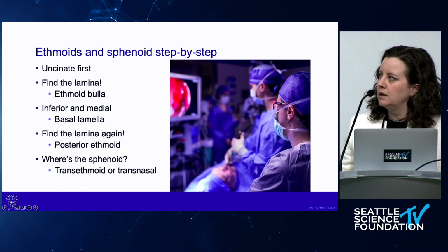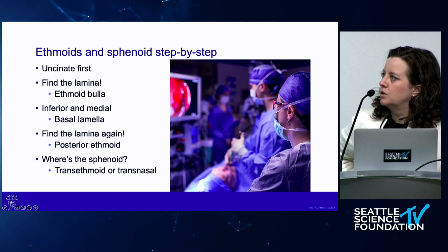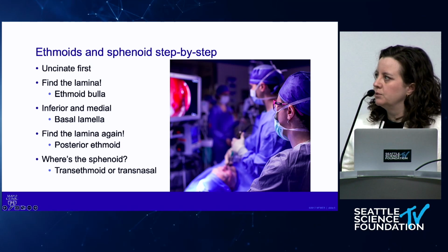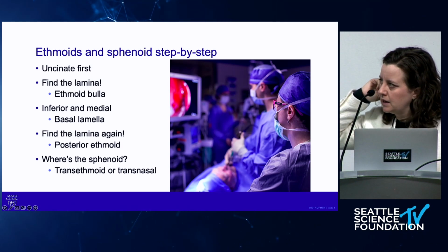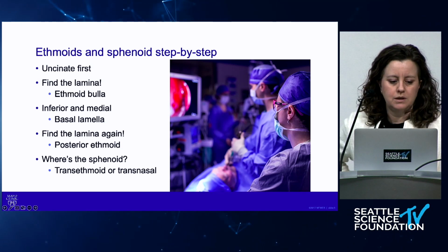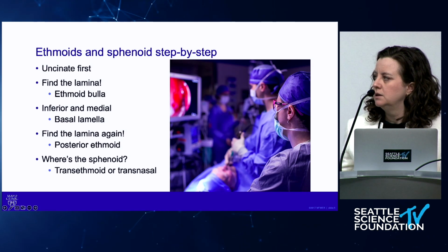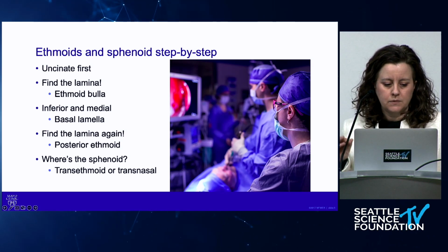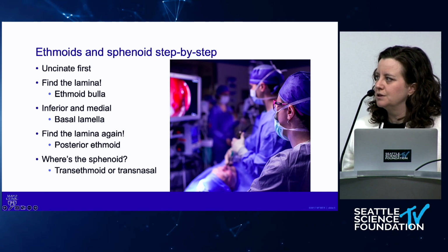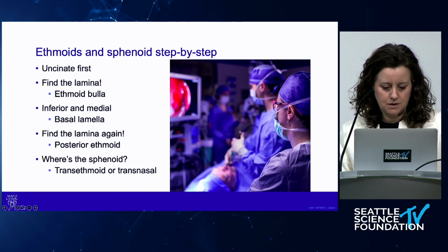And I'll just quickly outline the steps I take the residents through. And like I said, I hope a couple of these pearls might stick with you. First, the uncinate, which Brad talked about first, but again, just to briefly review, because you got to get the uncinate all the way down to do the ethmoids. We're going to find the lamina. That's our ethmoid bulla landmark. Get through the basal lamella, inferior and medial. We're back in the posterior ethmoids. We're going to find the lamina again, and then talk about a couple ways to get to the sphenoid.